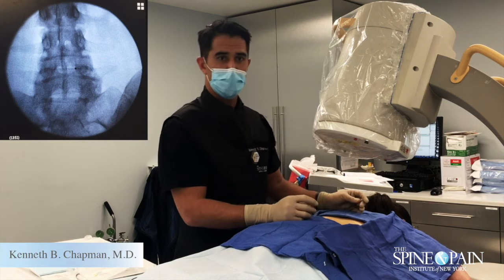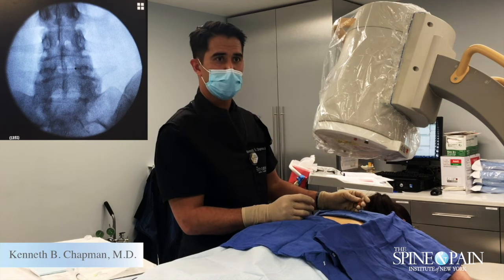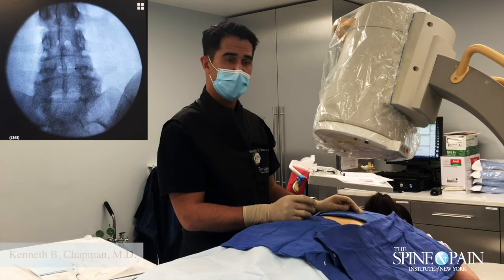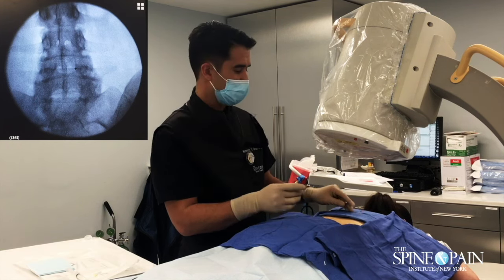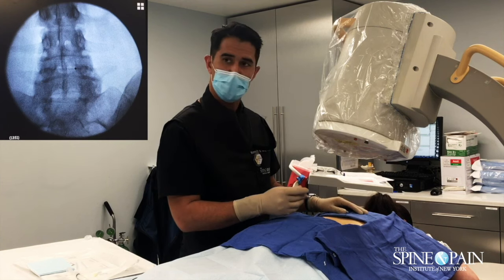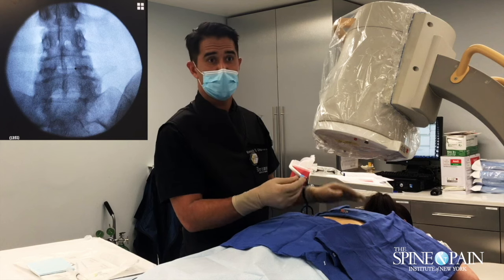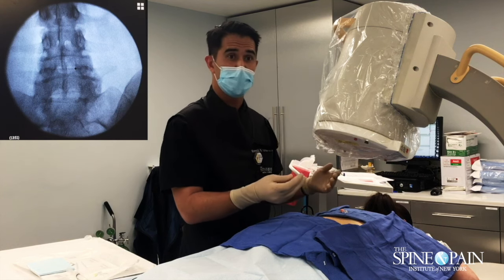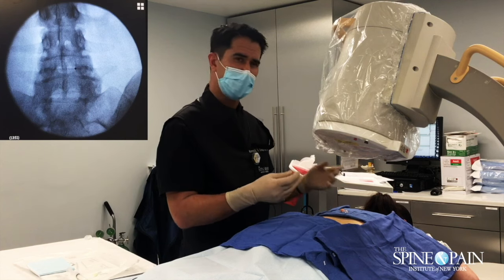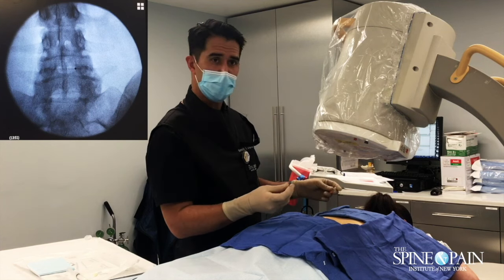We're going to do a lumbar medial branch block for our patient here. She's a 48-year-old female who was in a car accident and was having pretty bad back pain. She had a couple of epidurals and still had pain within the back itself. We did a block about a month ago, she had really profound relief with it, but the pain started to gradually come back, so we're going to repeat the procedure.